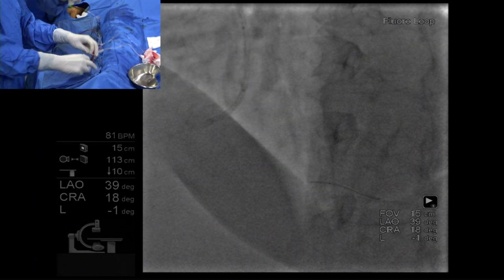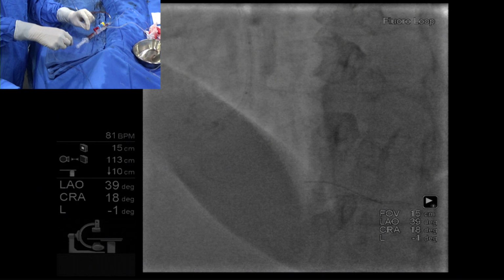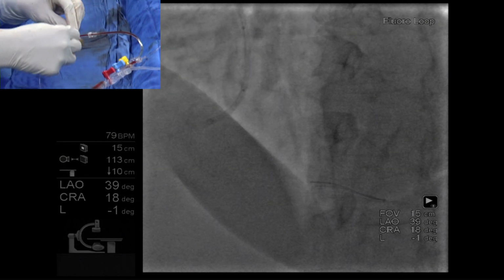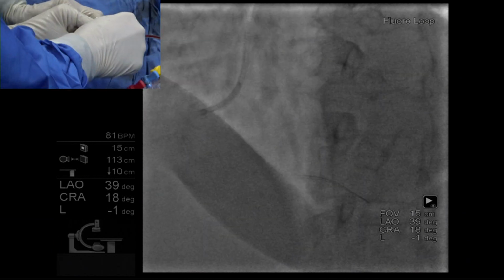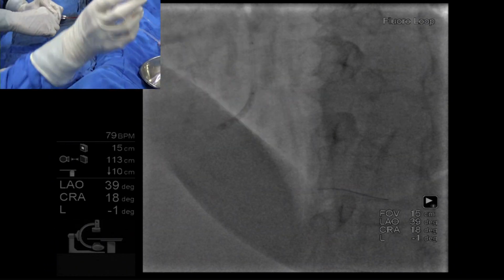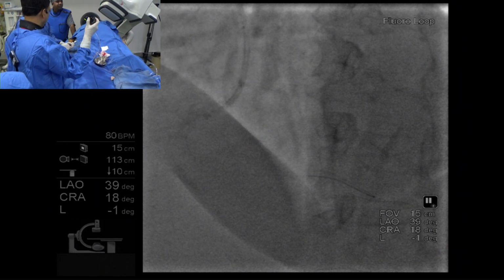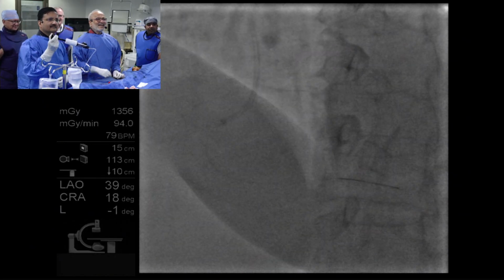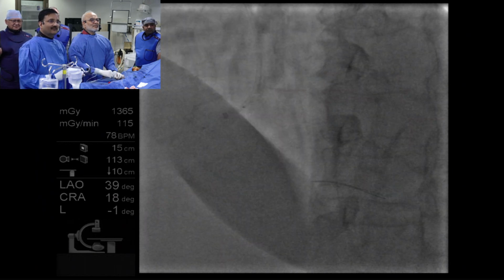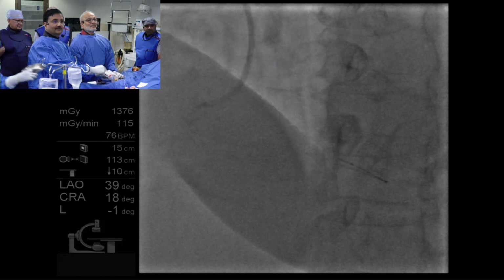It is very easy. It is a syringe. I am putting the wire here, balloon here, and I'm just pushing. And it goes in. This is the default thing in our lab. Every new fellow or whosoever joins as a new cardiologist, we teach this. It's amazing, Sanjay. That's your legacy. We're passing it on through many generations. So all around the world, everybody uses this now. Yes, this is in.